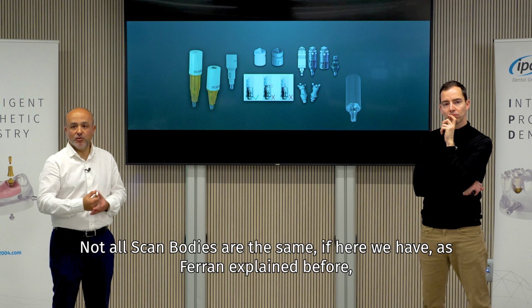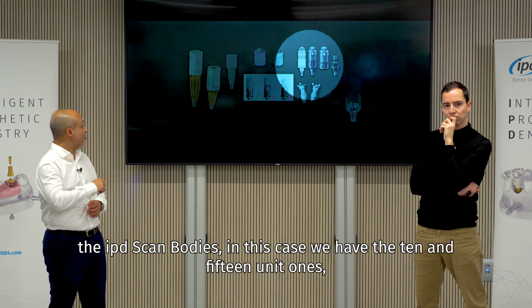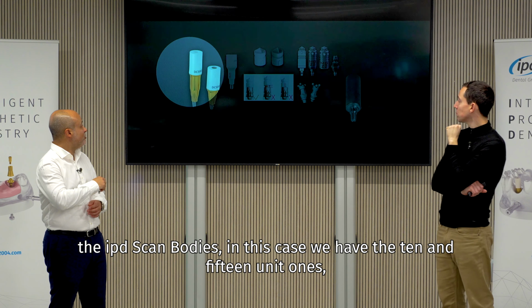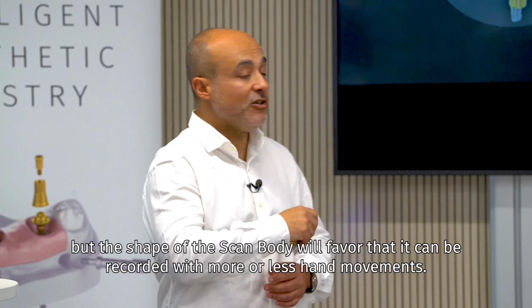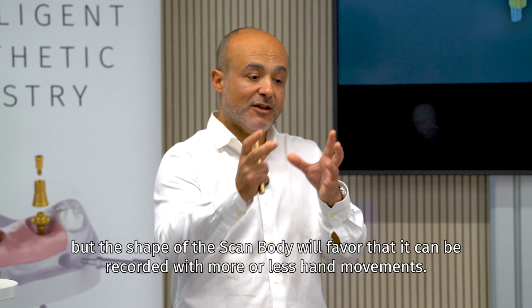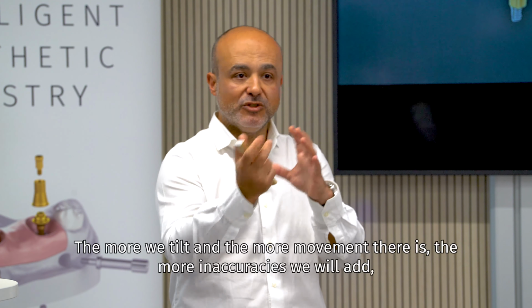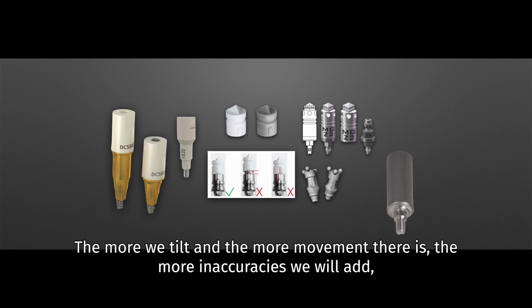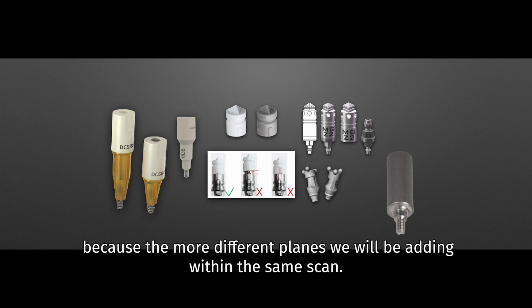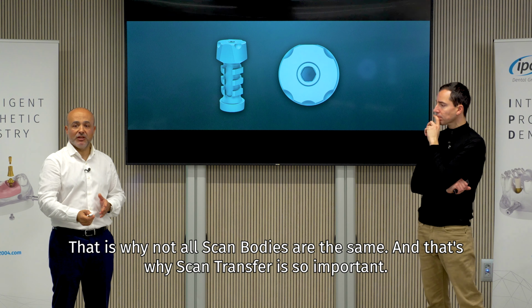Not all scan bodies are the same. As Ferran explained before, here we have the IPD scan bodies, in this case the 10 and 15 unit ones, but the shape of the scan body will favor that it can be recorded with more or less hand movements. The more we tilt and the more movement there is, the more inaccuracies we will add, because the more different planes we will be adding within the same scan. That's why not all scan bodies are the same, and hence the importance of scan transfer.